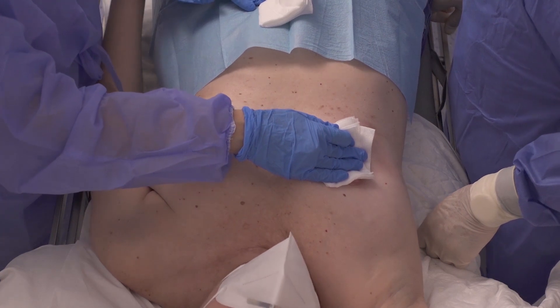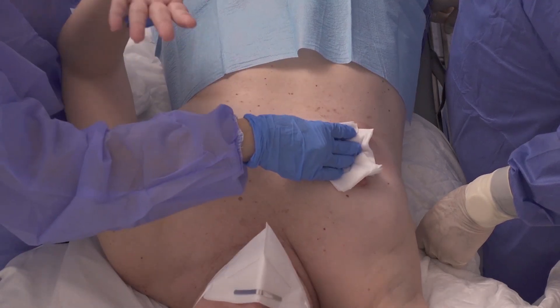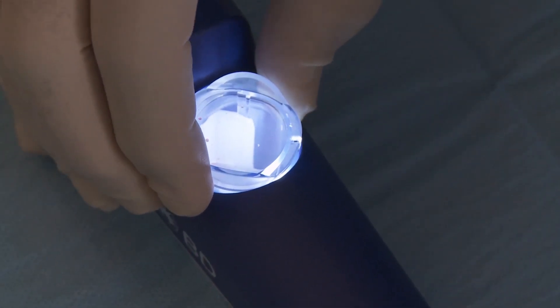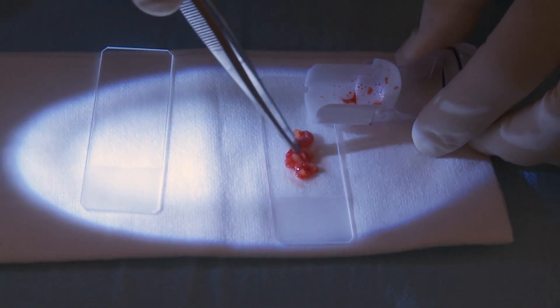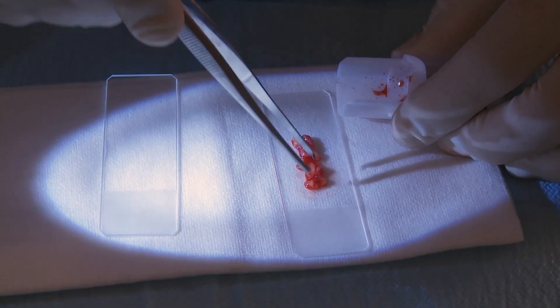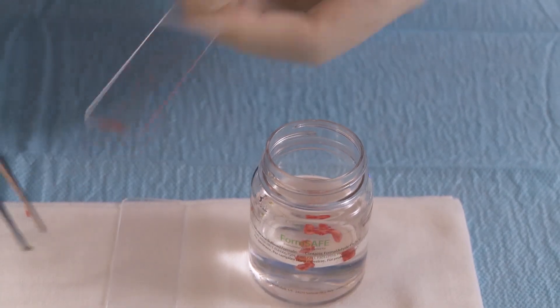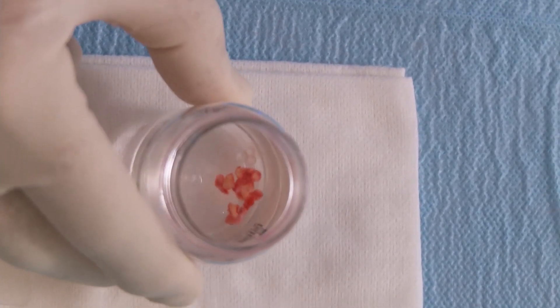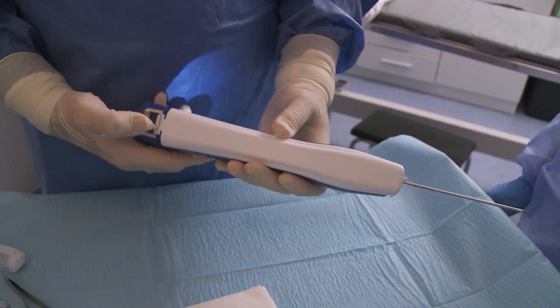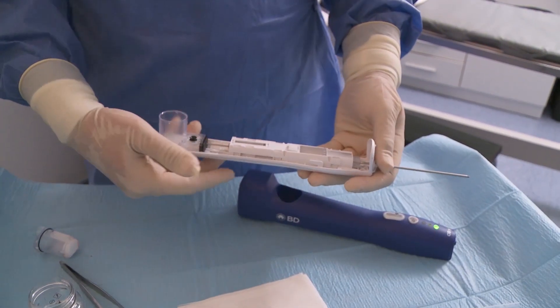Proceed with patient care and sample preparation. Detach the sample container from the probe and move the samples to the formalin container. Detach the probe from the driver and dispose of appropriately. All parts are disposable except the driver, which must be cleaned before next use.